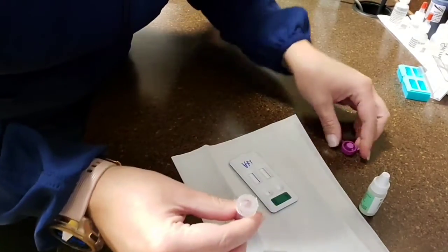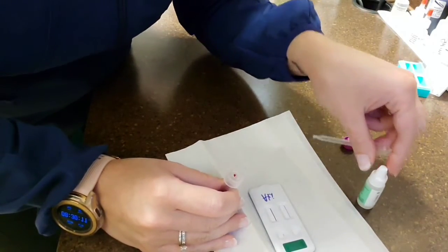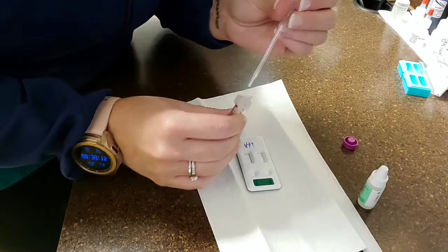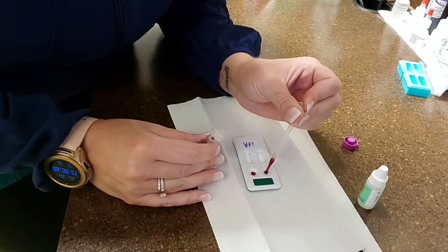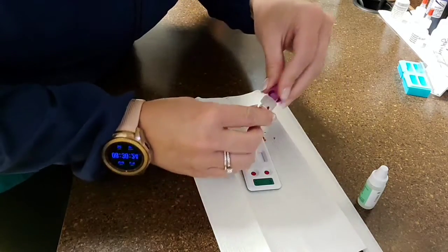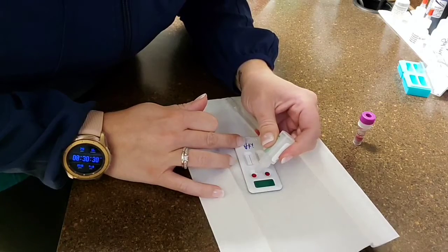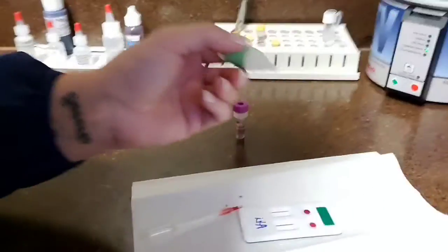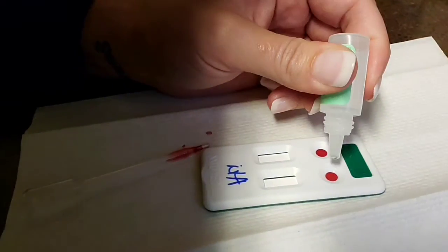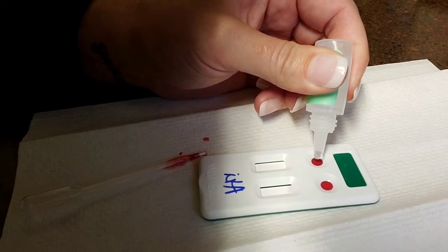All right, so to perform this test, I'm going to open up my sample. I need 1 drop of blood in each bay, as well as 2 drops of our buffer here. Make sure you can see that. All right, so we have 1 drop in each tube. Go ahead and set this down here. I'll let you see this a little bit clearer. Maybe we can get in here. All right, there we go. And so we've got 1, 2, 1, 2.